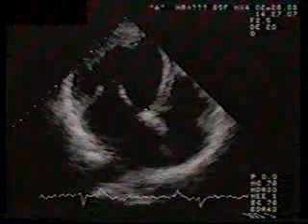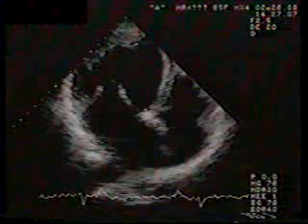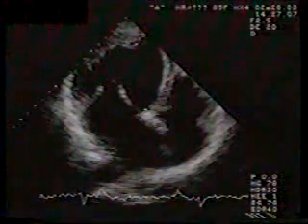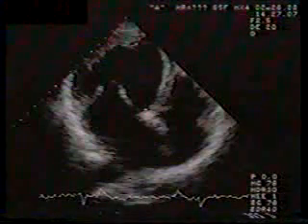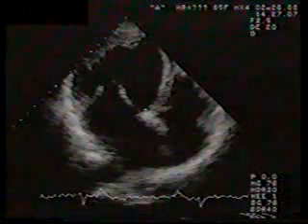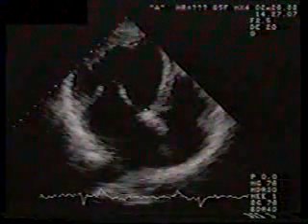In our day-to-day practice, we assess the mitral leaflet thickness from the two-dimensional exam rather than from M mode. Myxomatous valves are usually evident by simple visual inspection, but the leaflet thickness can also be measured to document abnormality. In this apical four-chamber view, the cursors will be used to measure the leaflets.